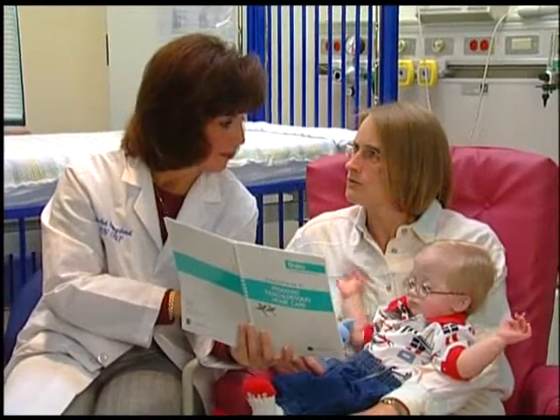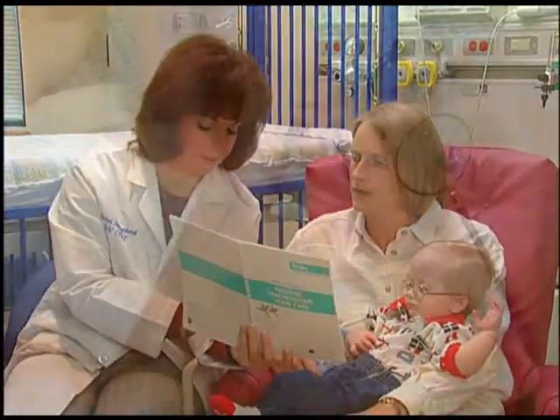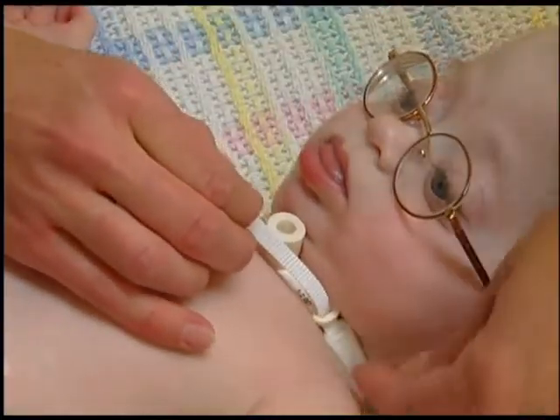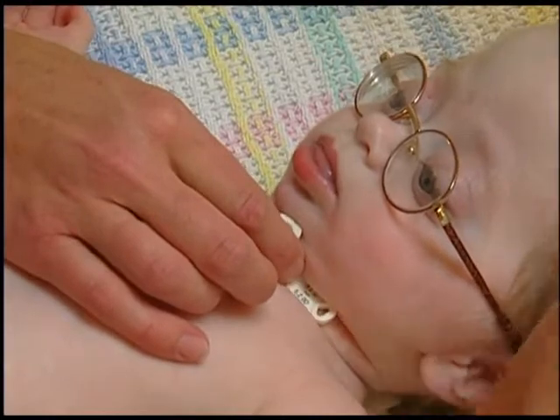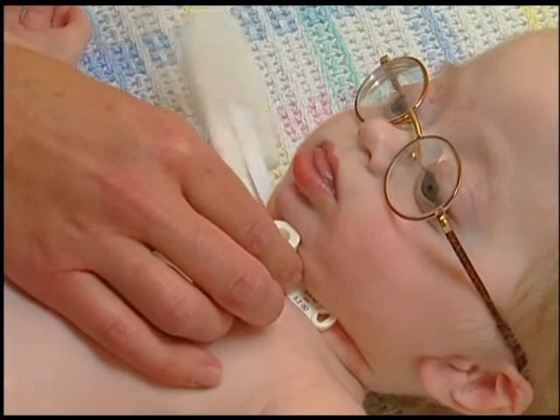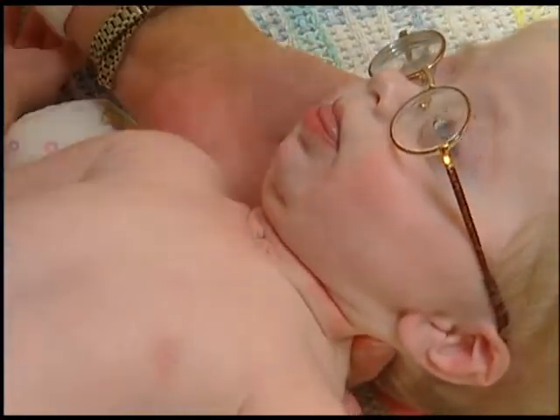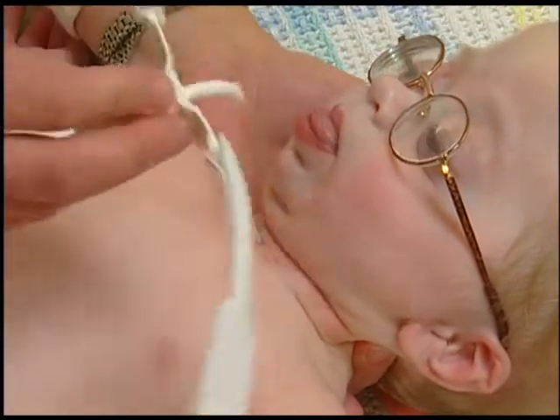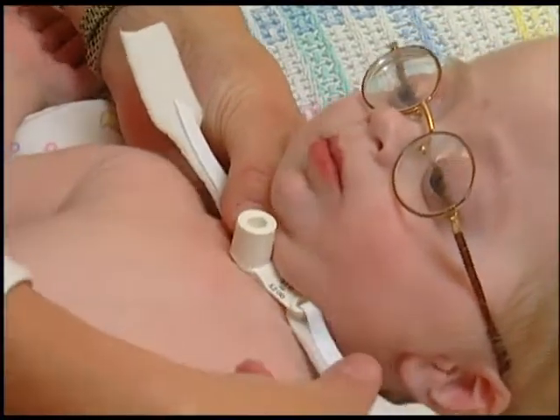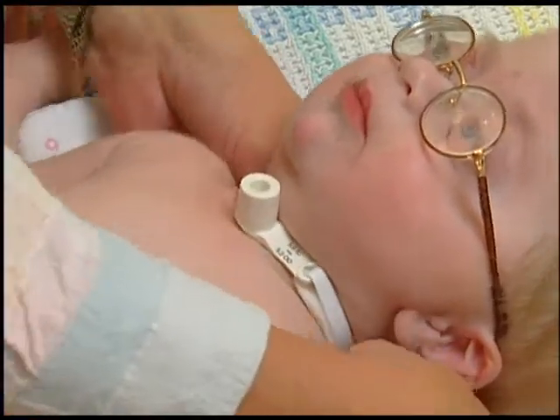Changing the tracheostomy tube can be one of the most anxiety-producing aspects of your child's trach care, but with practice, it becomes much easier. The entire tracheostomy tube should be changed at routine times as instructed by your healthcare team. It should also be changed anytime your child is having difficulty breathing that does not improve with suctioning, or if it is difficult to slide the suction catheter into the tracheostomy tube. Remember, when in doubt, change the tracheostomy tube.